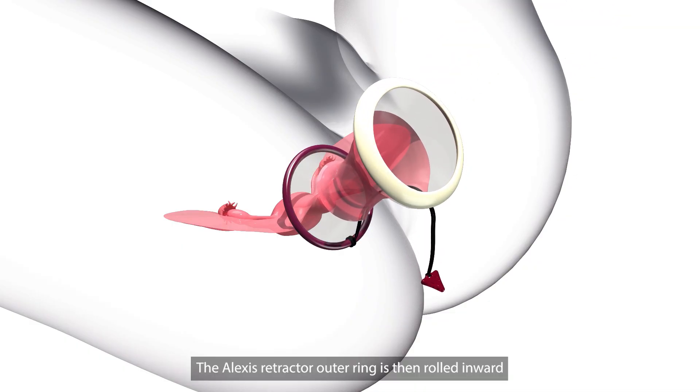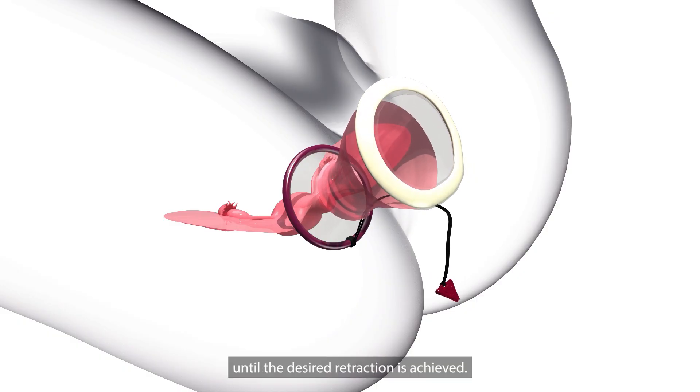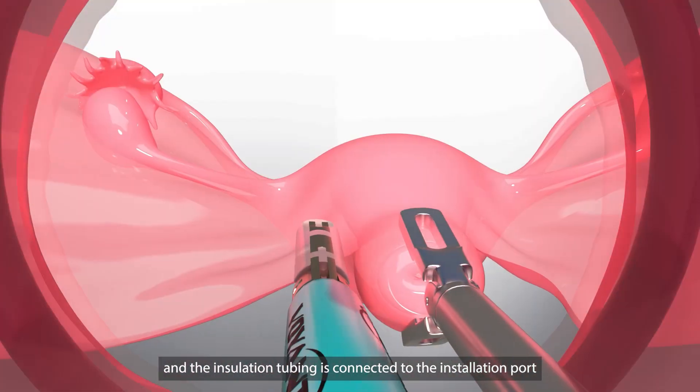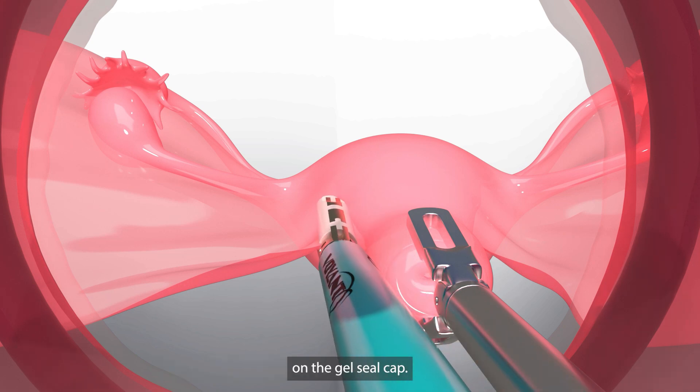The Alexis retractor outer ring is then rolled inward until the desired retraction is achieved. The gel seal cap is secured to the Alexis retractor by closing the lever, and the insufflation tubing is connected to the insufflation port on the gel seal cap.